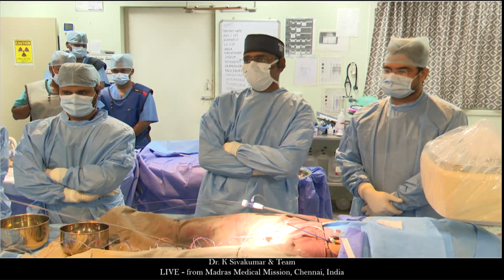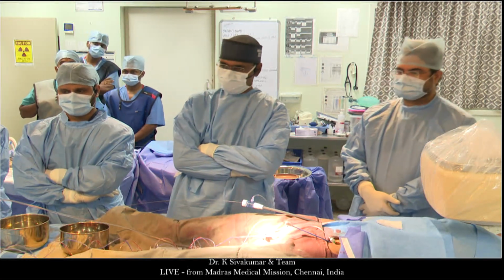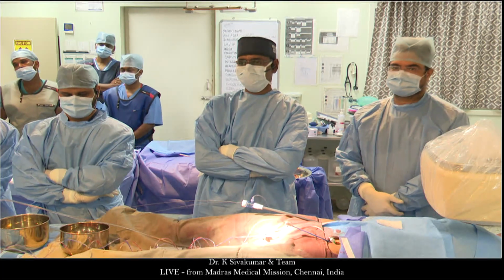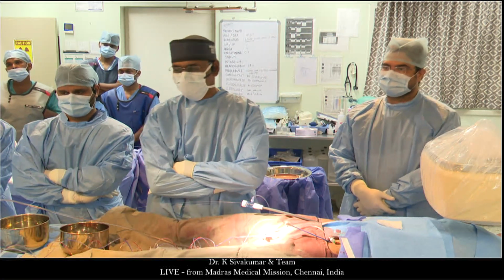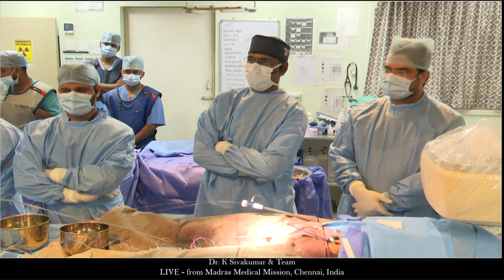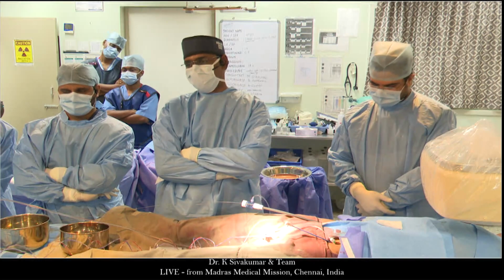Is Zuhair here? Yeah, Zuhair, we have a surgeon here. Zuhair, do you want to come to the microphone and tell us your thoughts as a surgeon when you see this patient? How old is she exactly, Sivakumar? 43 years. So she's a 43-year-old lady with mild pulmonary arterial hypertension, normal coronary angiography, and a large left-to-right shunt.